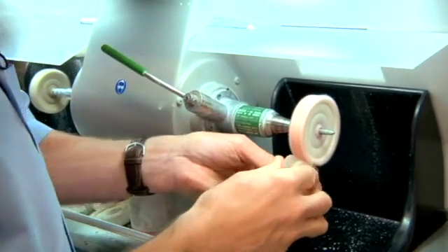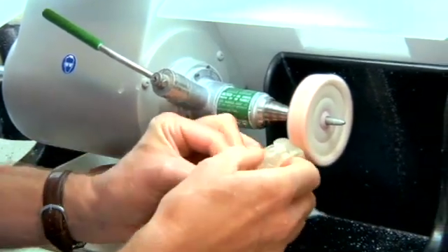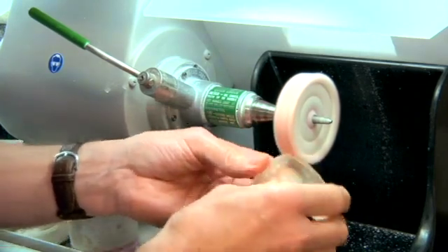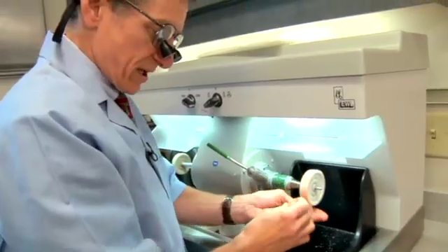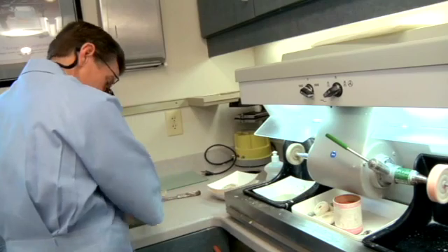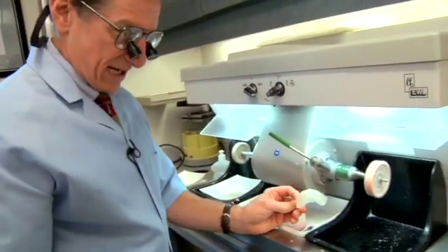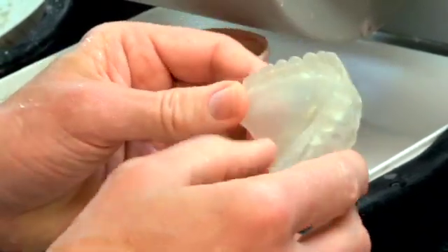Sometimes when I'm polishing, I'll drop back and slow the lathe down just a little bit. You don't want to use a wet wheel for this procedure, you want a dry wheel, smoothing it up so it's comfortable if we use it in a patient's mouth. Rinse it off again, scrub it with a brush, dry it a little bit, and as you can see now, we've got a polished, smooth, clear duplicate that can be used for many different tasks in the process.